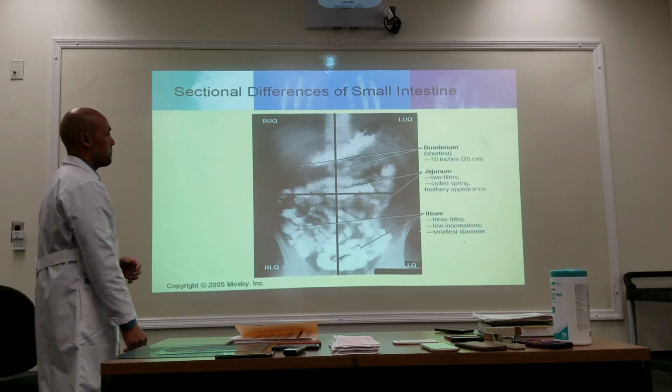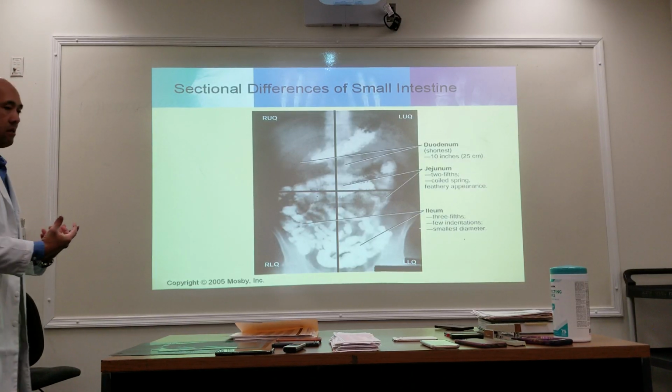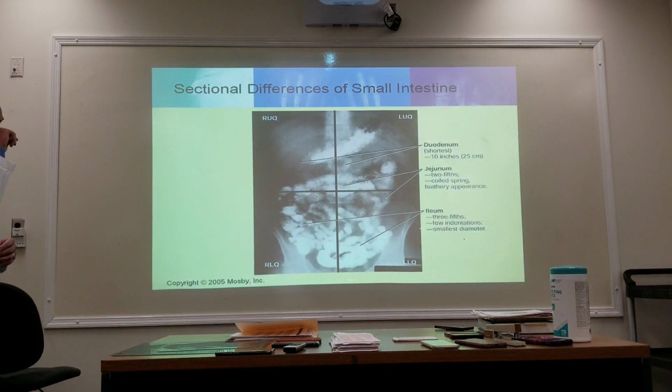Now, the way a small bowel study works is that we do them in segments or times, sequential time images. Let's just go ahead and jump forward.